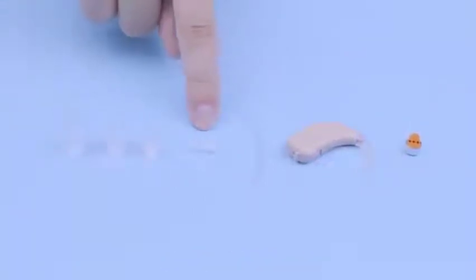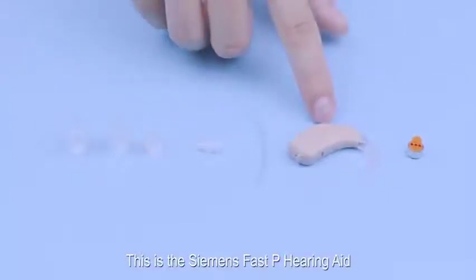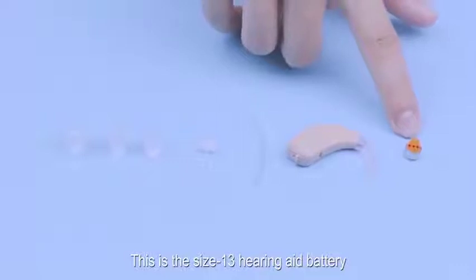This is the elbow connector. This is the tube. This is the Siemens FastP hearing aid, and this is the size 13 hearing aid battery.